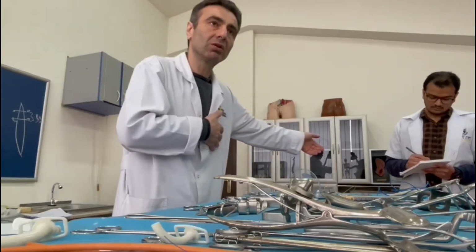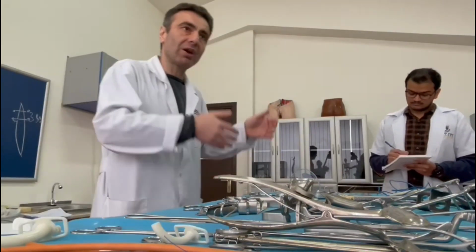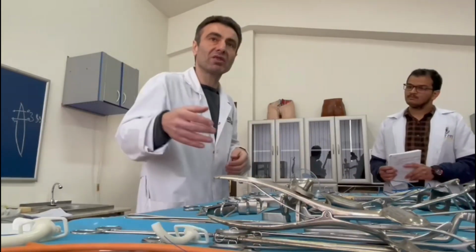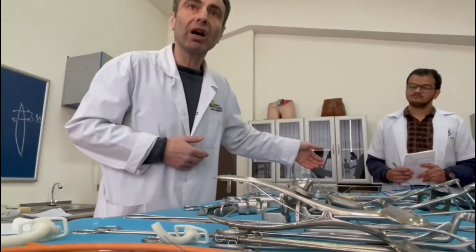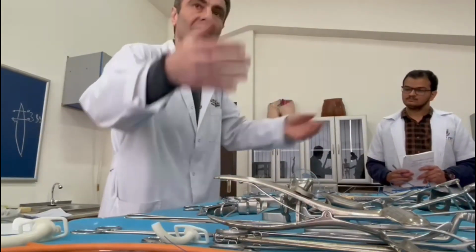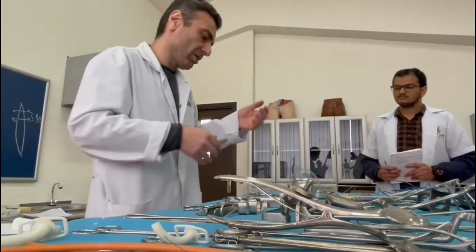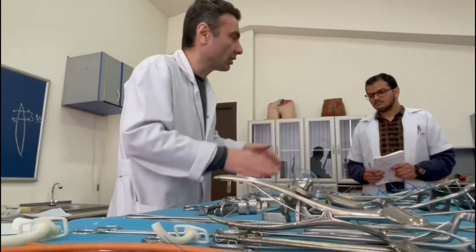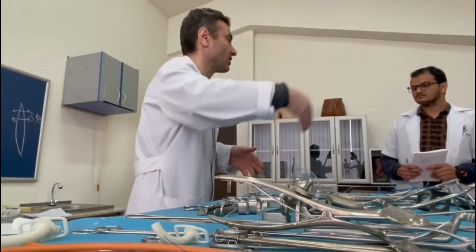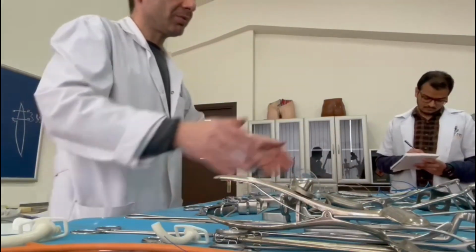As I told your friend in answer, if you make any incision, you damage the vessels. If you damage the vessels, it gives bleeding. If it gives bleeding, you must arrest it. Otherwise, if we lose a critical amount of blood, we will be dead, or we will have big problems. Let's say group number 2 is created to arrest the bleeding during operation or after some traumas. Doesn't matter.